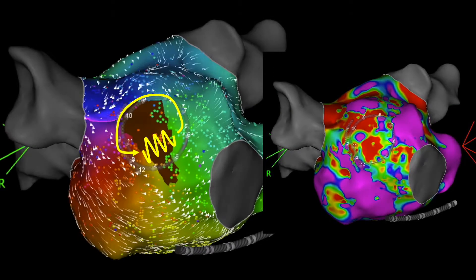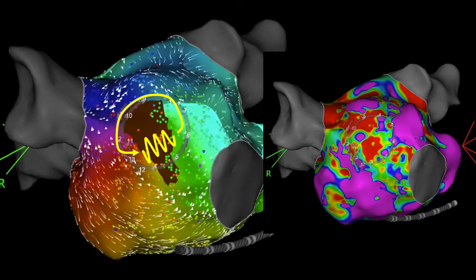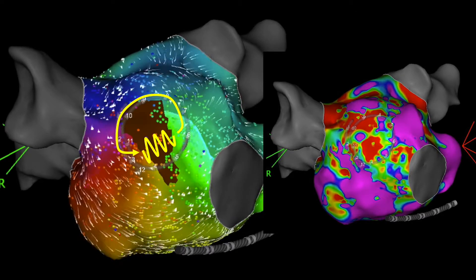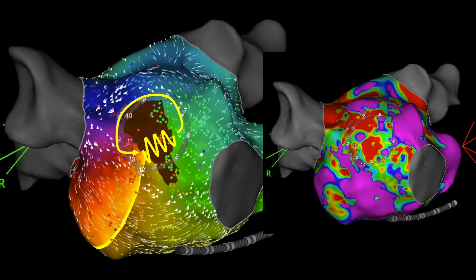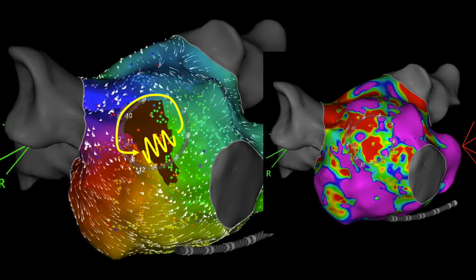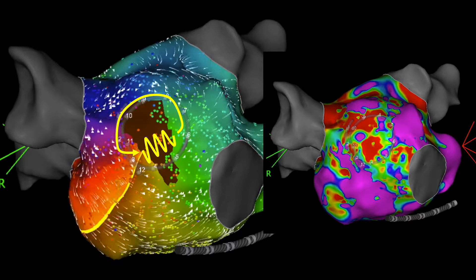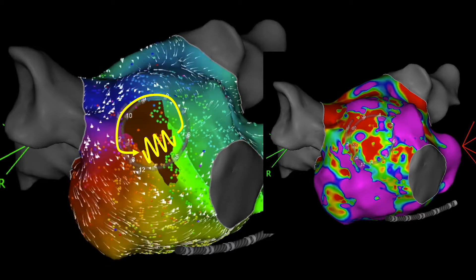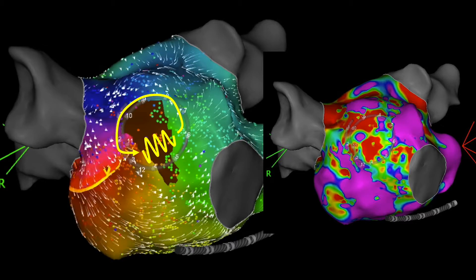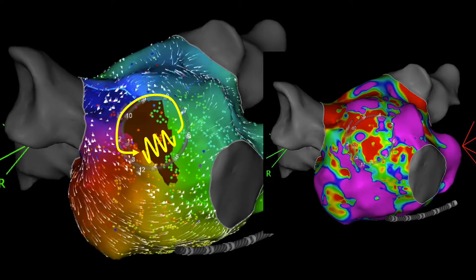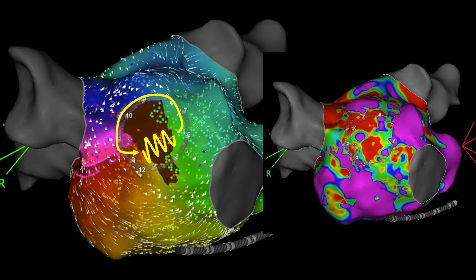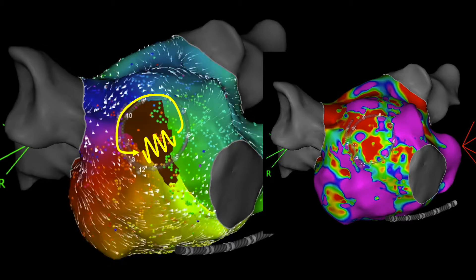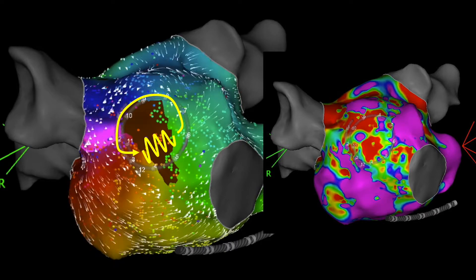On the right side, the substrate mapping shows a large septal low-voltage area not related to previous ablation. On the left side, we see the coherent mapping showing a micro-reentrant septal atrial tachycardia related to the pre-existing septal scar area.